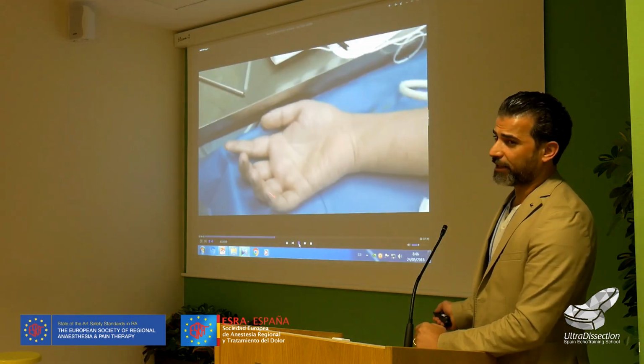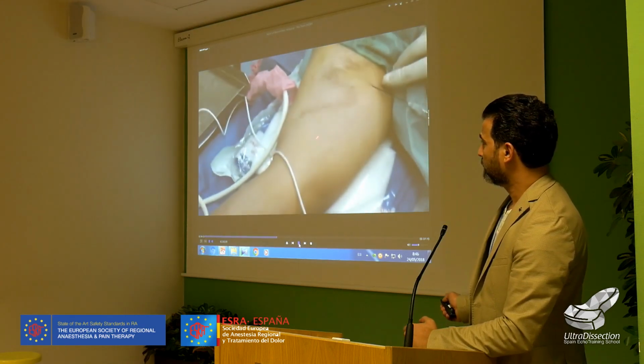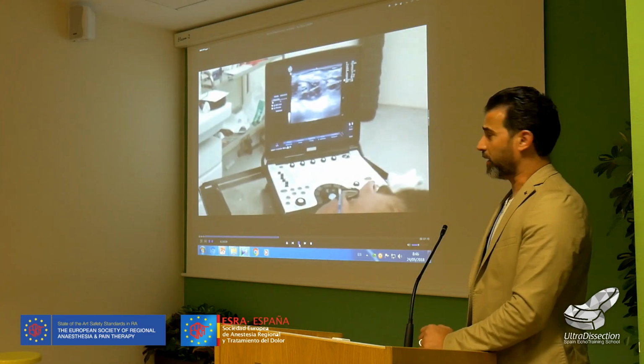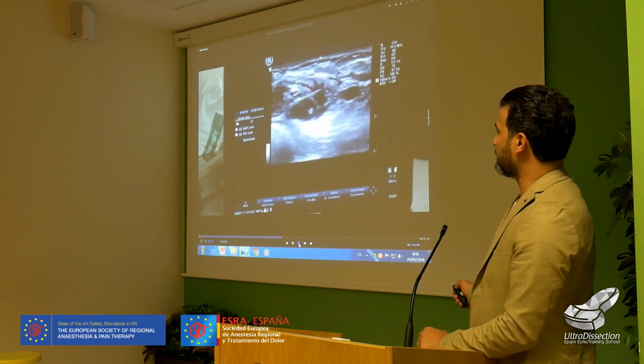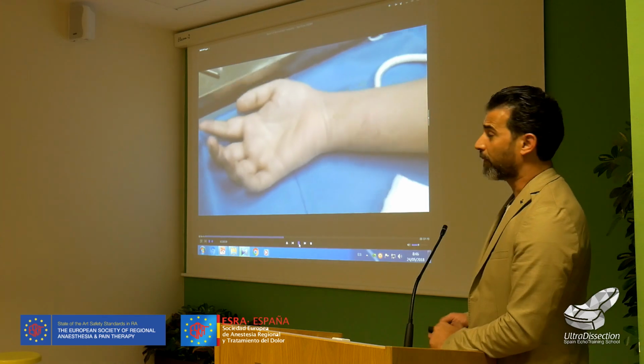Now I start electrical stimulation. This is the hydrodissection now here, from this level. Direct electrical stimulation. This is the nerve now. See, this is the thickening, it's separated from the nerve, the thick fibrous tissue.